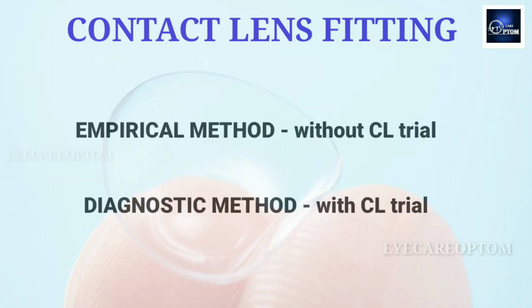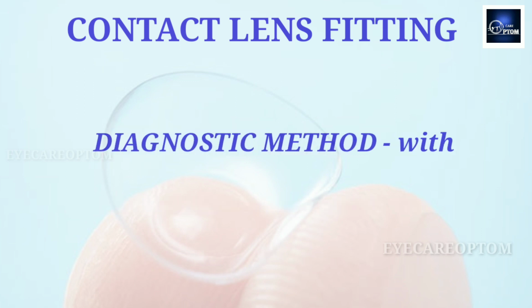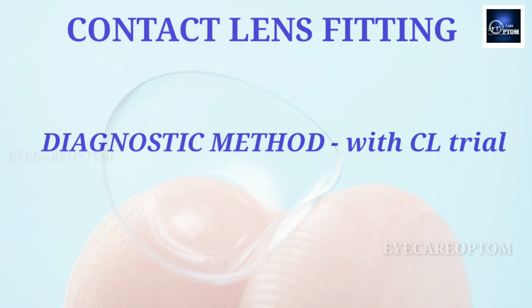In empirical fitting, we'll prescribe the contact lens power without any contact lens trial. But in diagnostic fitting, we'll prescribe the final contact lens after a contact lens trial. In practice, this diagnostic fitting method is followed as a standard method for contact lens fitters.